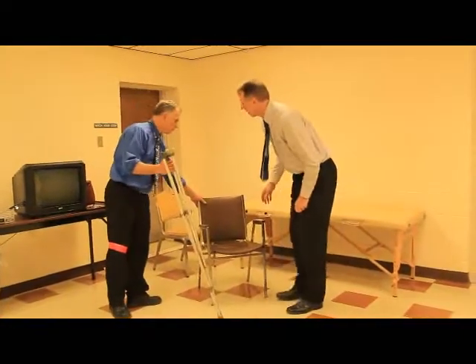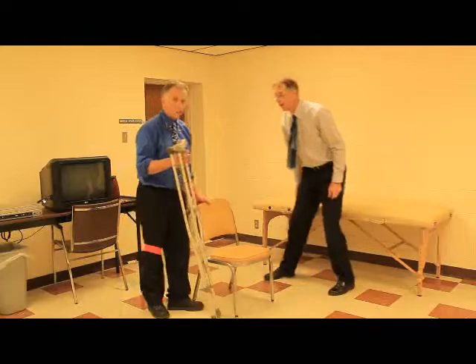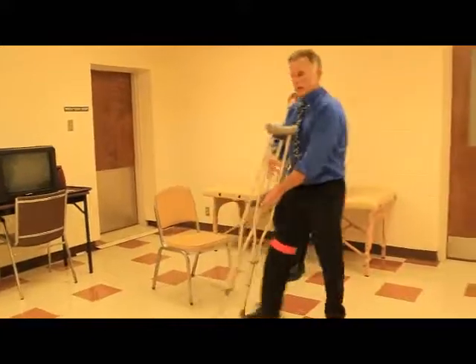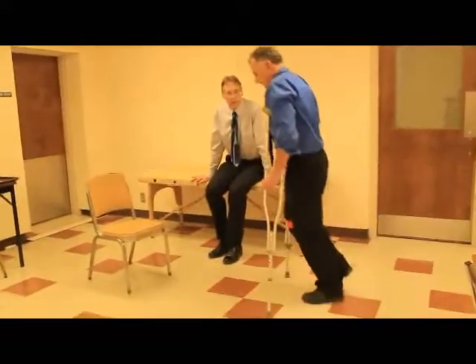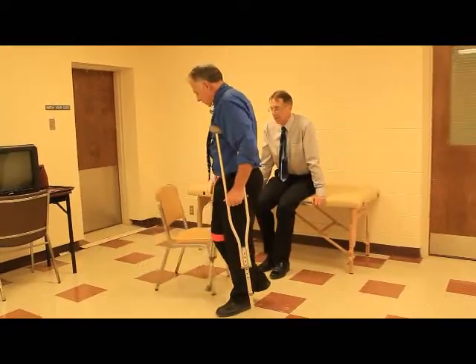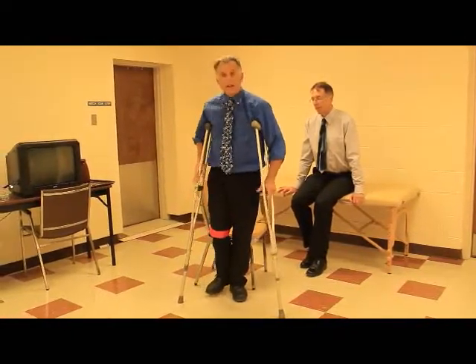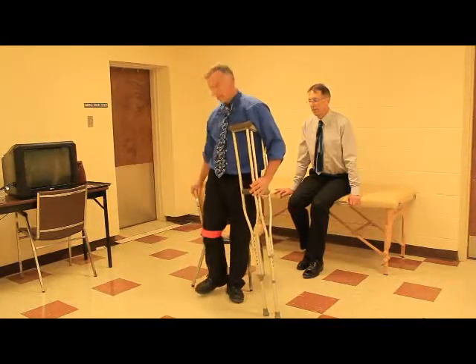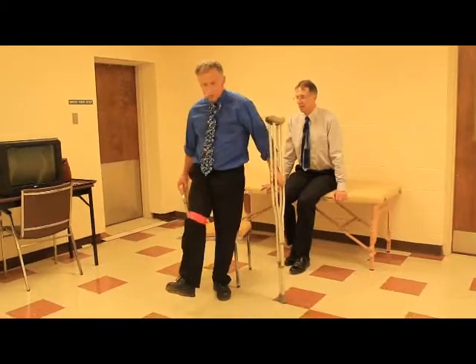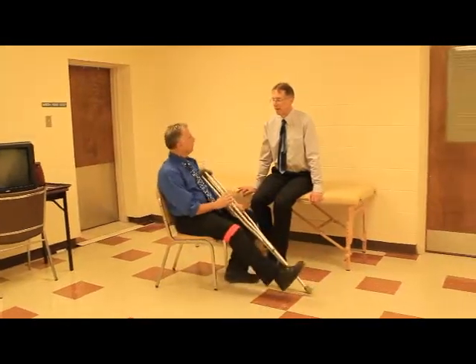We're now going to show you how to get up and out of a chair with no armrest — a little more tricky, but once you learn the trick it's no problem. You're going to come to the side of the chair. Now you have an automatic armrest right here — the backrest becomes the armrest. Get these two crutches together, grab that backrest, put your sore leg out in front of you, and slowly lower yourself down. And voila.